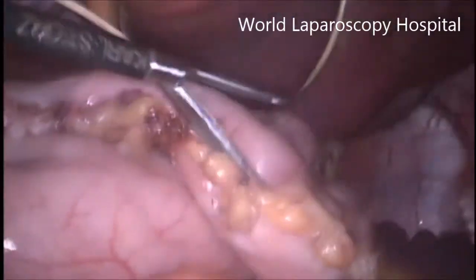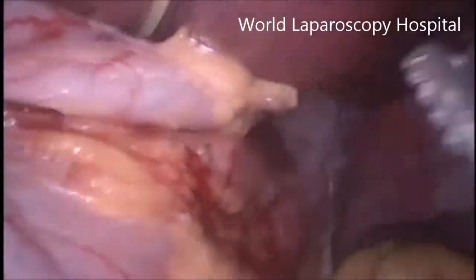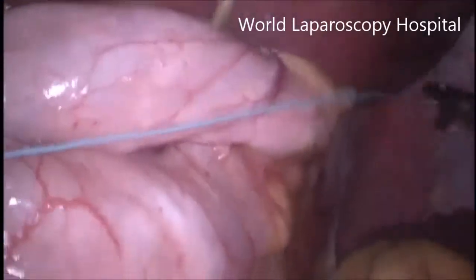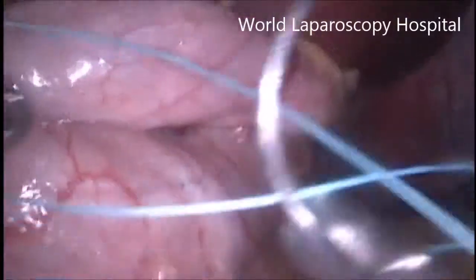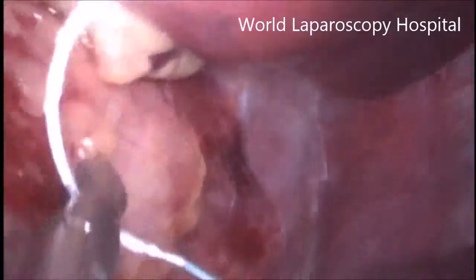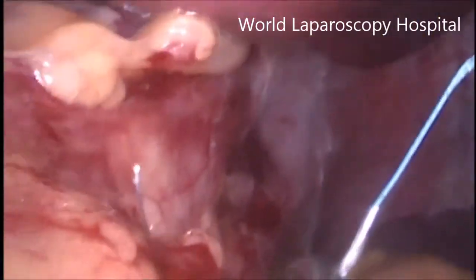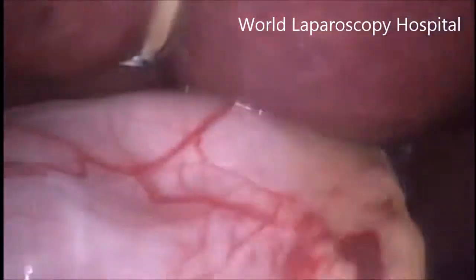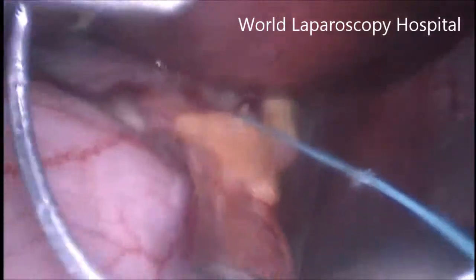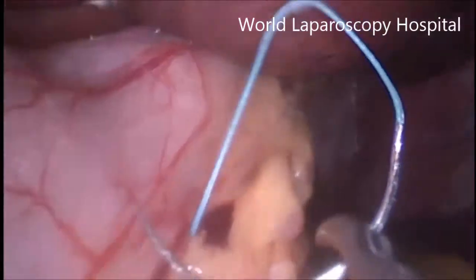Now the gastric plication, actually we are reducing the stomach; it is also a type of restrictive procedure. You can reduce the capacity of the stomach without cutting the stomach. It is a very cost effective procedure. Care should be taken that when you are suturing, multiple bites should be taken over the greater curvature and then the posterior wall of the stomach, so that no dead space is left. Otherwise sometimes there is a collection, and that collection can convert into pus pockets.